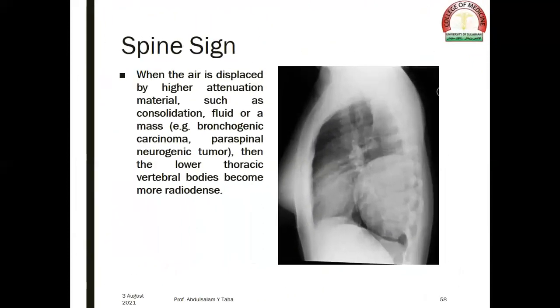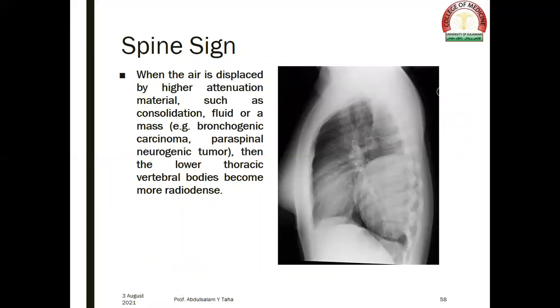The spine sign: when the air is displaced by higher attenuation material such as consolidation, fluid, or a mass — like bronchogenic carcinoma or a paraspinal neurogenic tumor — the lower thoracic vertebral bodies become more radiodense. Here, the lower thoracic vertebrae are more radiodense due to the presence of a posterior neurogenic tumor, and this is a positive spine sign.